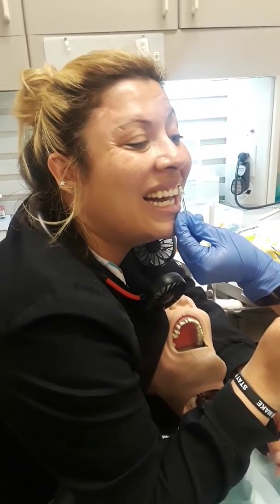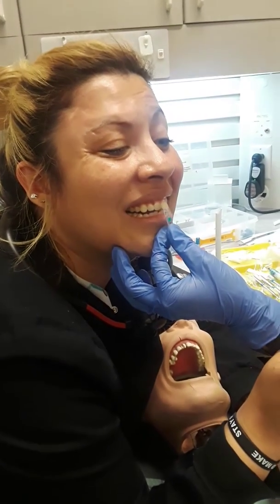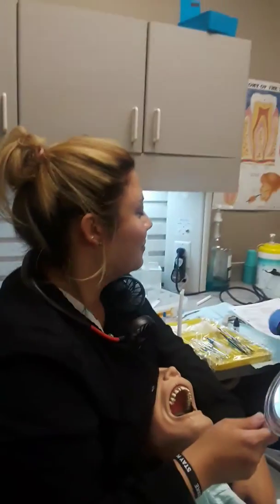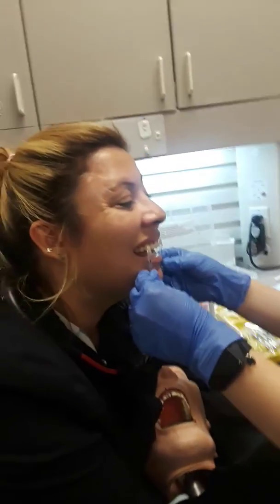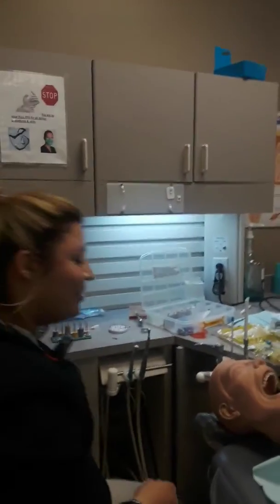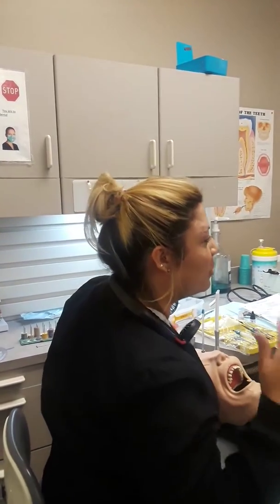Put one shade tab on the right and one on the left, hold both up, and let the patient pick. That's how you do a shade check, especially if you have multiple shades to compare.